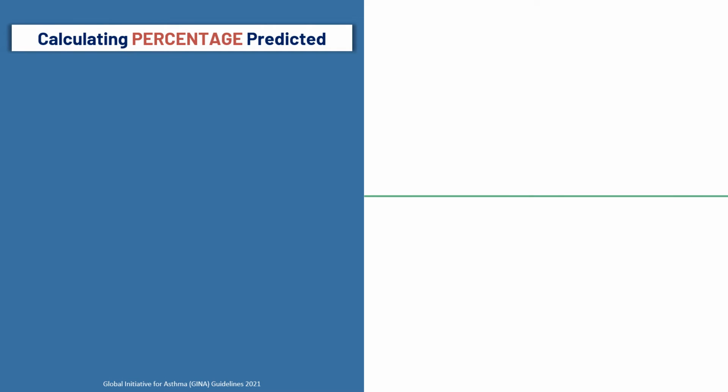Now then, you've got your readings. Let's pretend now that your patient's come into the surgery and part of your review is I've got to check the peak flow. So it's okay recording it and saying, oh, this is 290 litres per minute. But is that good or bad? We need to know what it is as a percentage of the predicted. There's another one that we use, it's the percentage best, and I'll show you that in a second.